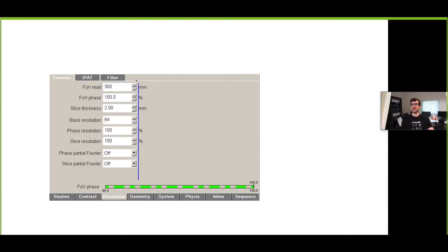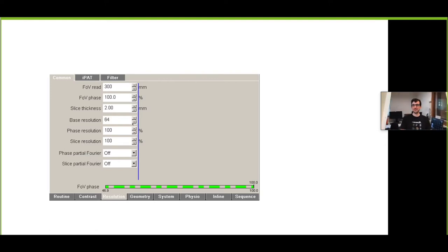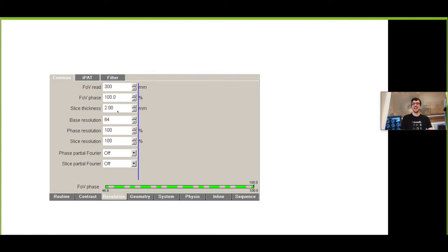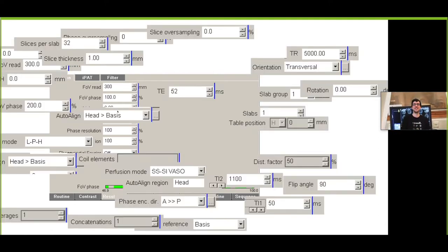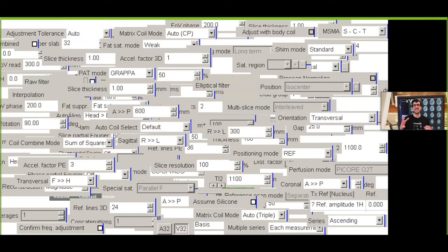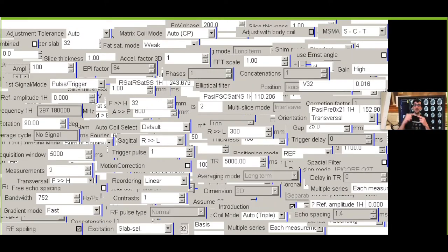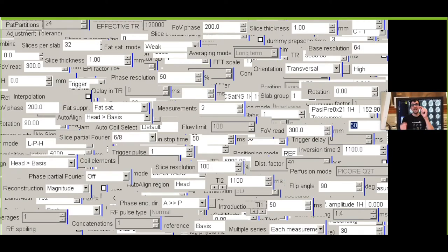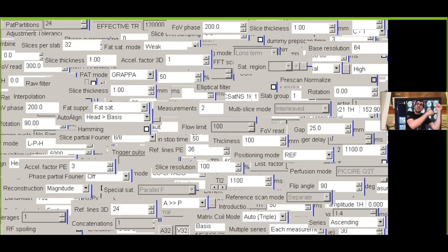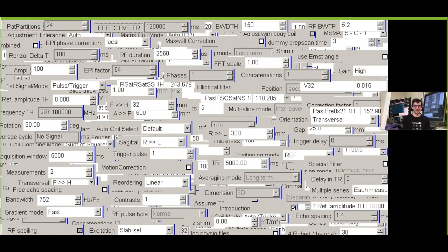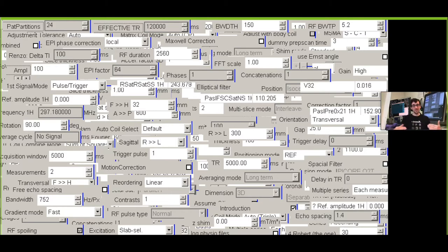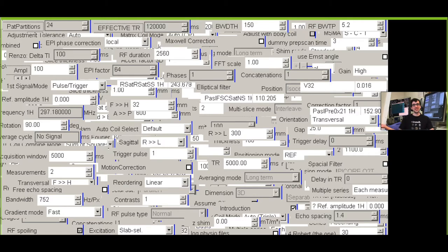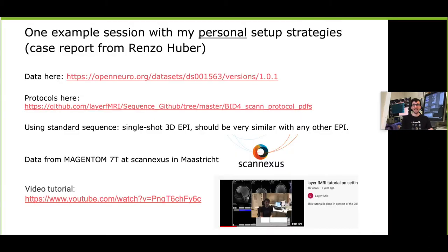So here are just a few of them in the so-called protocol editor task cards. In fact there are many task cards here and even subtask cards and this is just the tip of the iceberg. There are so many parameters and the challenge here is that there are interactions between those parameters, so as soon as you change one it has an effect on the other one and these interactions become multi-dimensional pretty quickly. Even this is just the tip of the iceberg because there are so many hidden parameters that didn't find their way into the protocol editor.